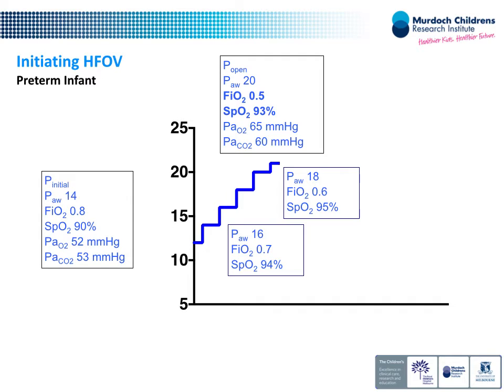We did a blood gas, and you can see there's an improvement in PaO2 at a lower FiO2. Our saturations are still in our target range, but our CO2 has started to go up and we've kept delta P constant. What's possibly happening now? Yeah, there's a clue here, we might be over-distending, right? Because if our delta P is the same and our CO2 is getting worse, it's got to be our compliance which has changed. We had recruitment occurring here and presumably an improvement in compliance. Now we think the compliance might be getting worse, and the only way that would be happening physiologically is if we're starting to over-distend them.